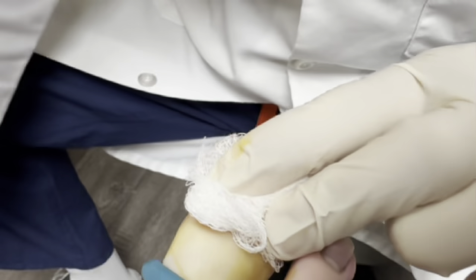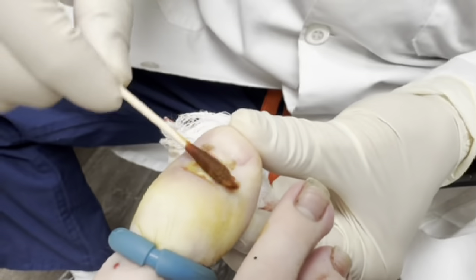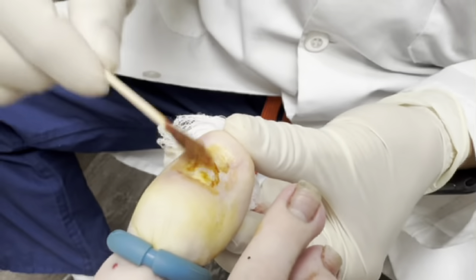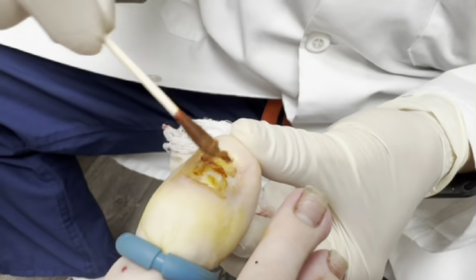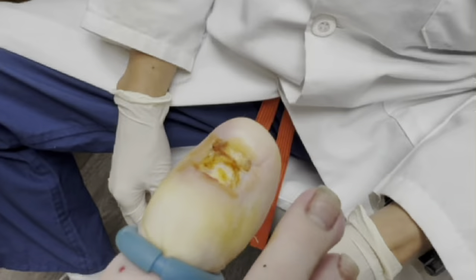I'm going to put a little bit of cautery down here just to get rid of some of the not-so-clean tissue, and then have them start soaking it tomorrow. Wrap it over nicely — that's it.